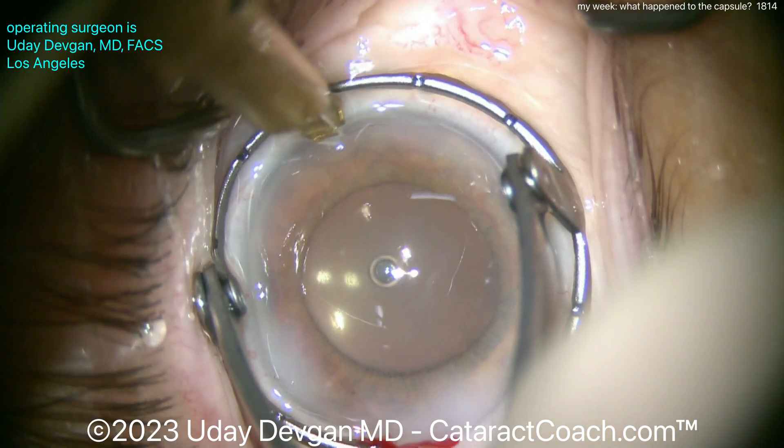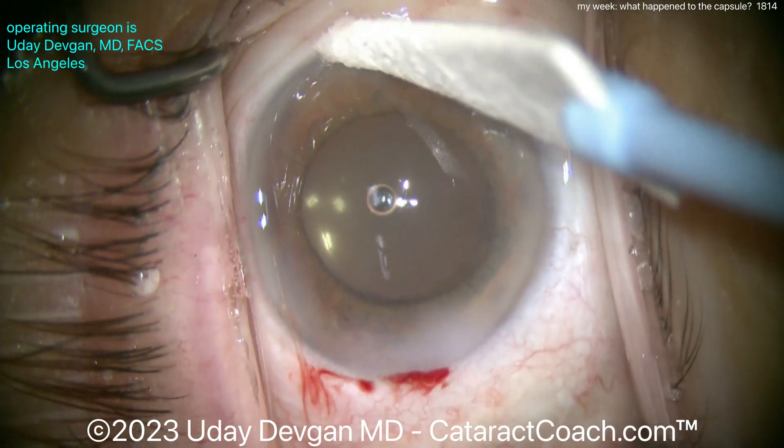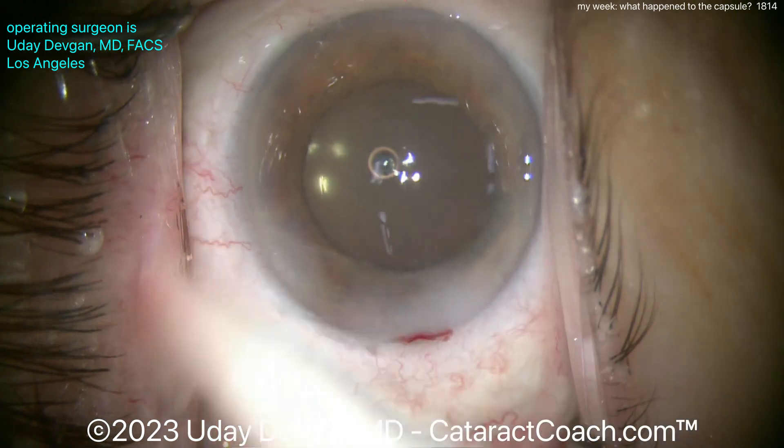Patients can have these loose capsular bags, and that can be more common in bigger, highly myopic eyes like this one — with a 28-millimeter axial length and a 10-diopter IOL. But we can handle it and everything goes beautifully. Check out the rest of this week's cases — even more interesting cases from my week.